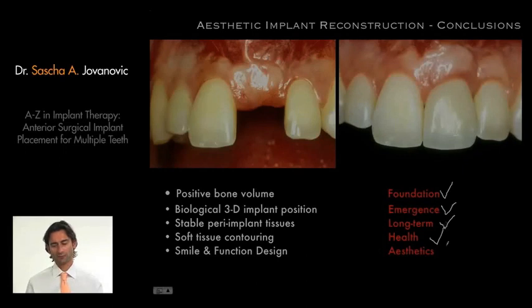And then the final, which is really the aesthetic treatment with restorations, that of course falls in traditional prosthodontics. We're doing multiple teeth, so you make a decision if it's going to be cemented or screw retained. So I hope that with this lecture on multiple teeth, you got insights on how to use this and some protocols and some criteria, how to be successful in doing this, as well as how to find the limitations in this indication. Thank you very much.